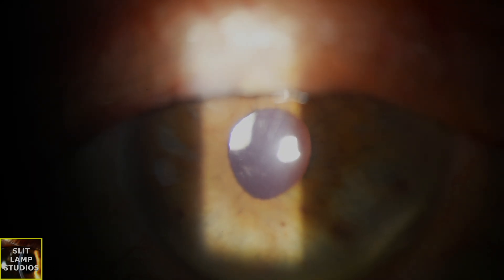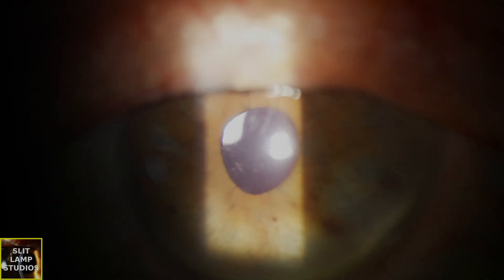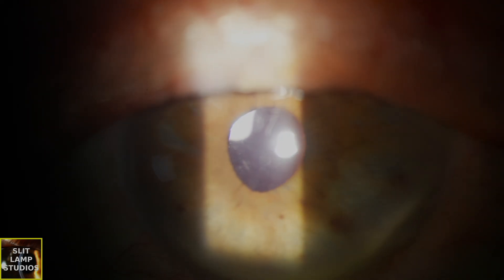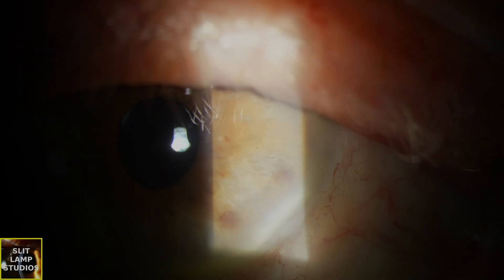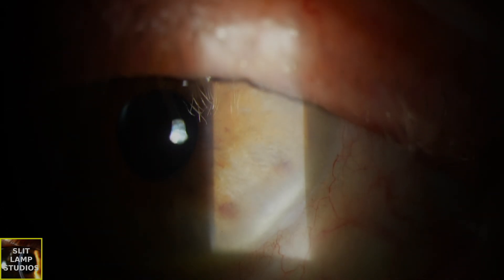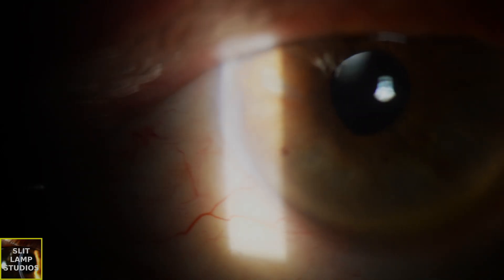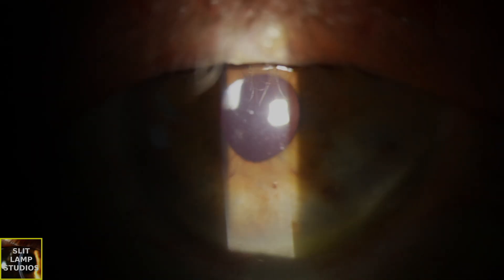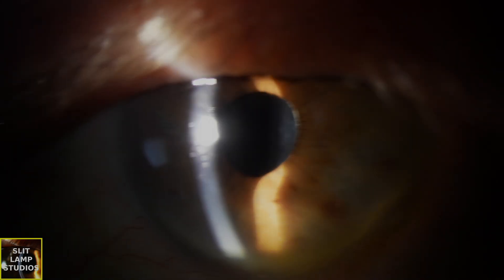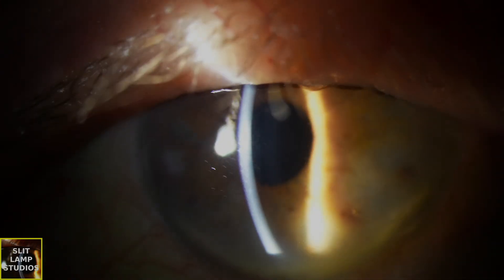Assessing the bleb is essential for monitoring the surgical success and identifying complications. We want to start by assessing the bleb's location — usually it's superior or superior nasal — and then we want to note its height, extent, vascularity, and presence of any leaks or encapsulation.